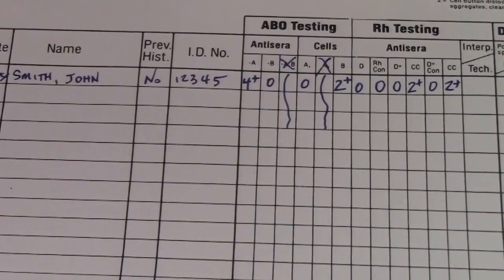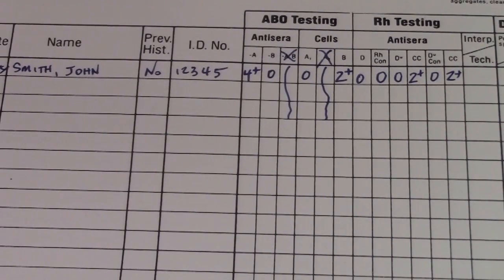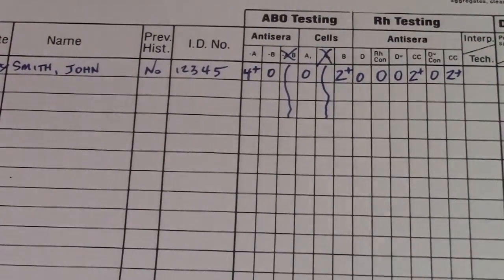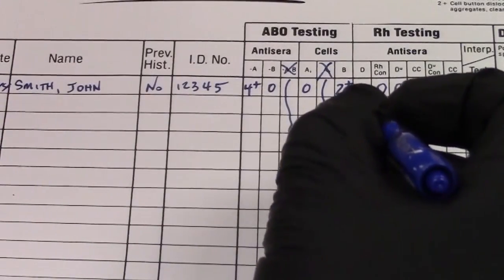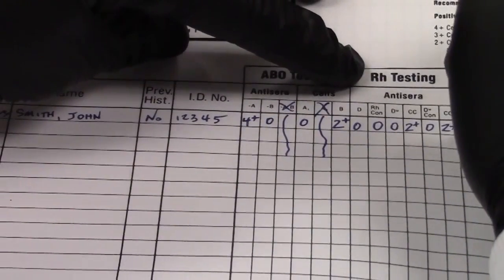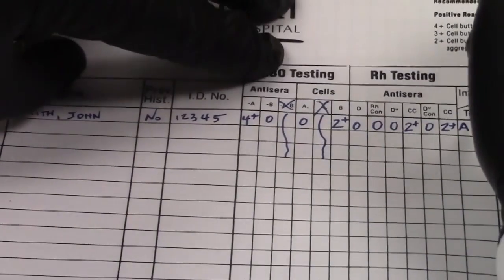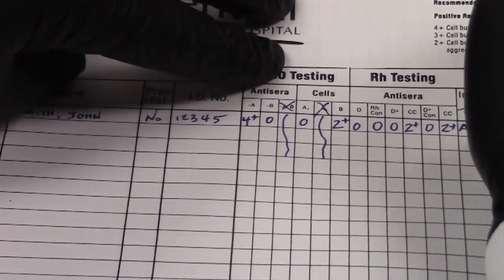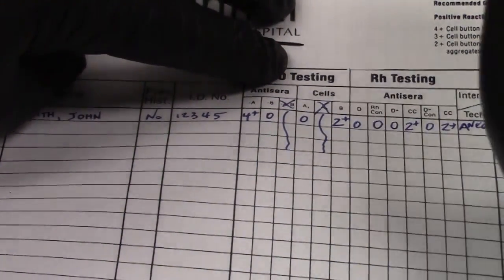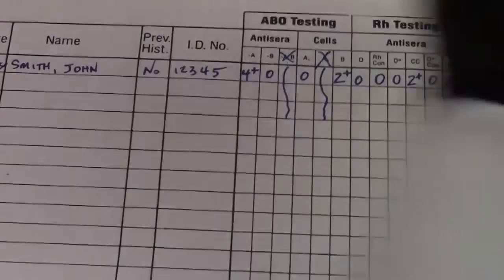All right, so all of our testing is checked out. Now what we need to do is interpret. So with the ABO, we look at our forward typing, and we have only the A. In our reverse typing, we should have the B cells. Now I know this is not the strongest reaction, but it's sufficient. So we're going to go ahead and call this patient A, and the RH testing all the way through weak D was negative. Now we are going to write neg. We don't just put two slash marks or an equal sign to indicate negative. We're going to write out neg. And the last thing is we're going to put our initials. Okay, finished. That was ABO RH with the weak D typing.